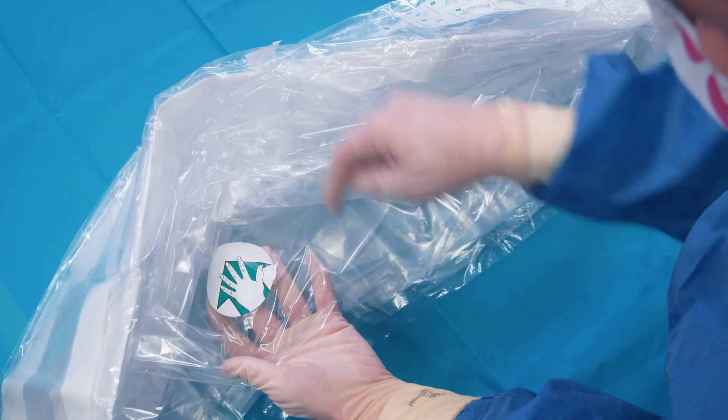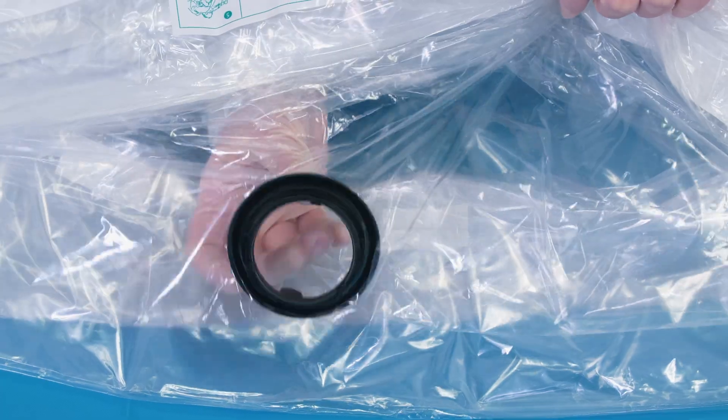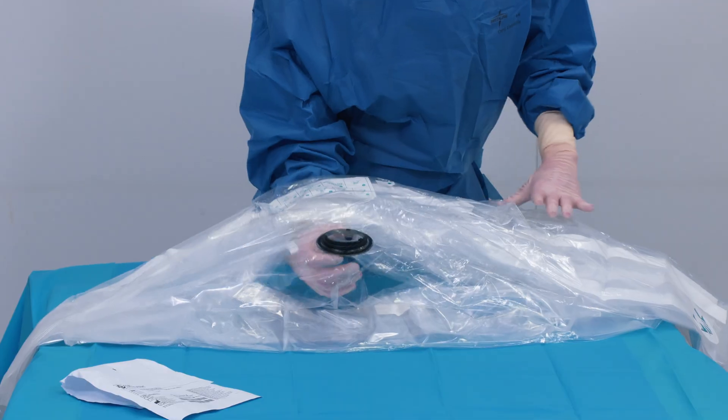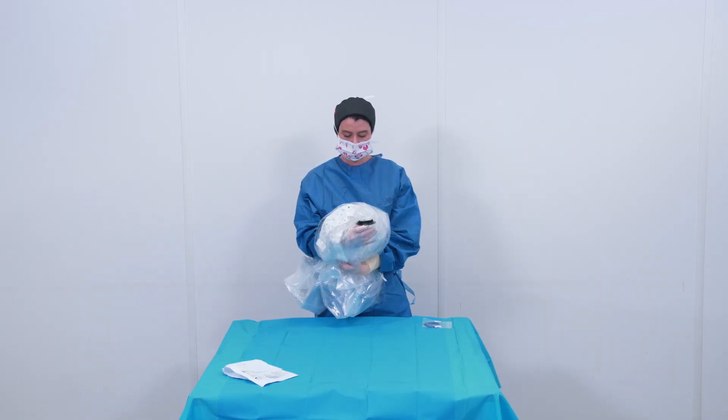Find the hand sticker and slide your hand inside the drape to find the lens cover. Hold the tab containing the white dot with your thumb and the other tab with your index finger. Lift the lens cover at the same time as the remaining drape.